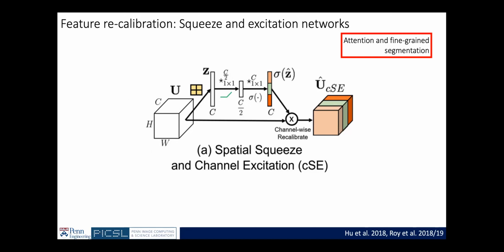Does this make sense? I'm squishing all the knowledge and converting everything into just one single channel, right? Then I can place these channels again to get the size H, W, and C. So first I squished all the voxels in one plane into these channels, and then I excited them and made them back into the same input size, right? So it's just recalibration of features.